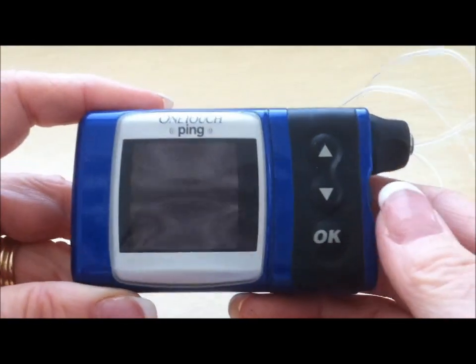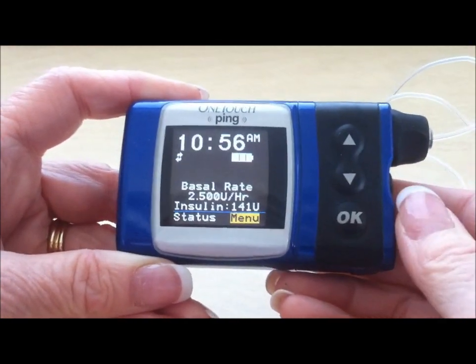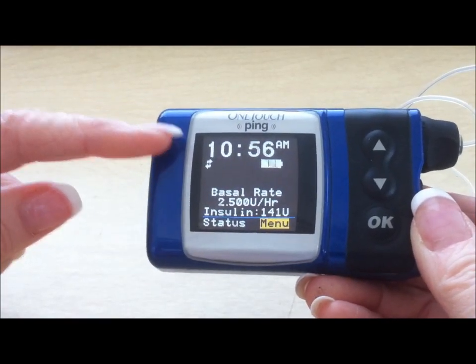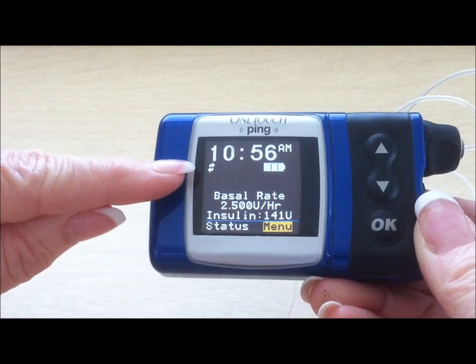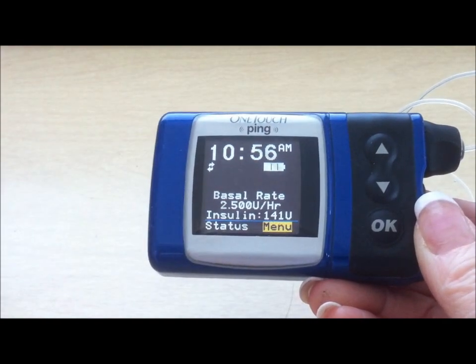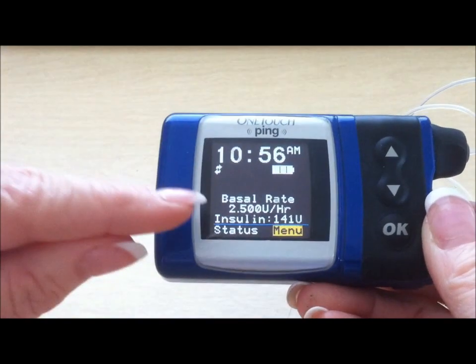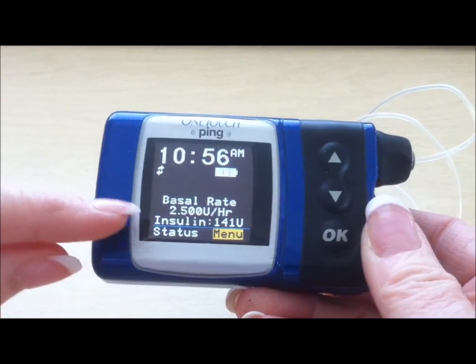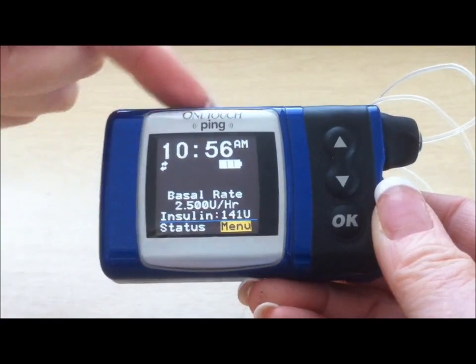To operate, to open up the pump or to wake it up, touch any button. You wake up the pump. The pump will display the time, the battery power. The back and forth arrow means that it is linked with a meter, which is not something that we're going to be using at camp. The current basal rate is 2.5 units per hour, and there's 141 units left in the reservoir of the pump.